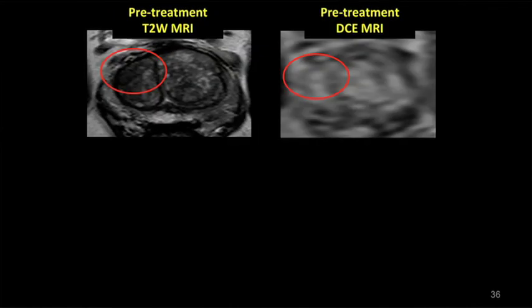And finally, we use MRI for guiding and monitoring focal therapy. We are currently doing laser ablation under MRI guidance. We use a commercial visualization system. And I'm going to show you just one sample case. We have done 14 cases so far. And this is a very, very unique case.